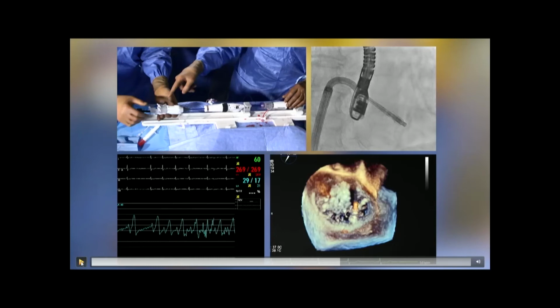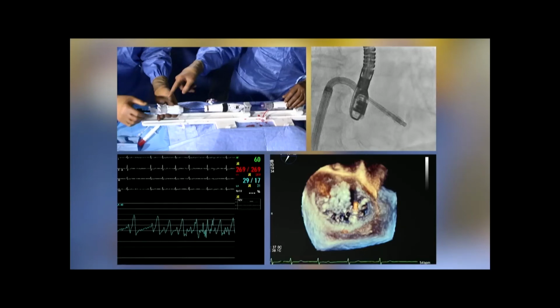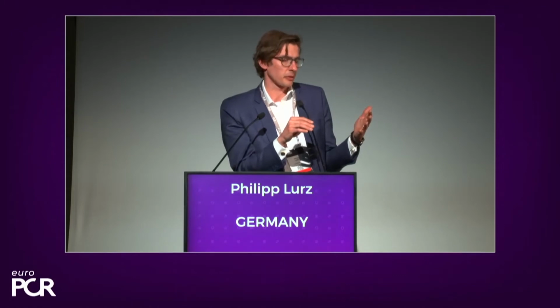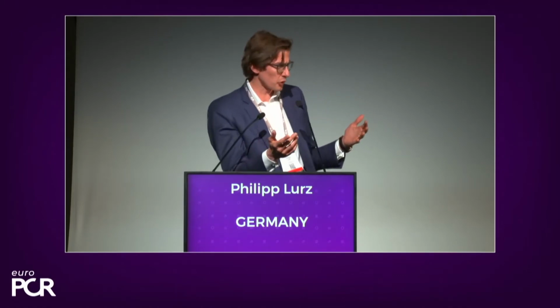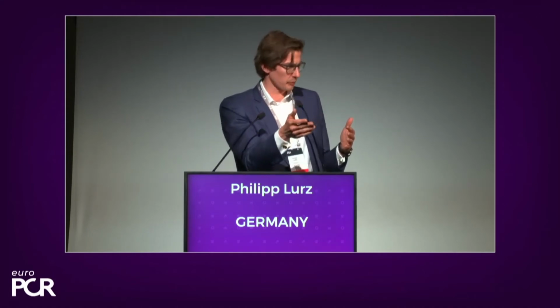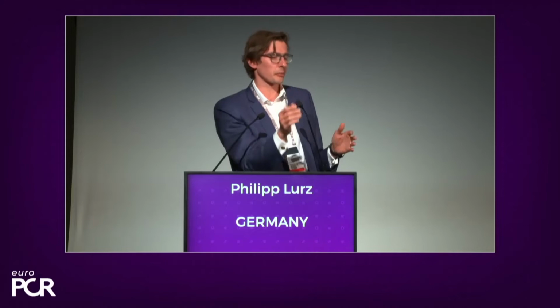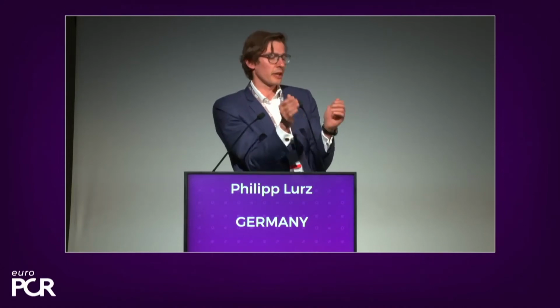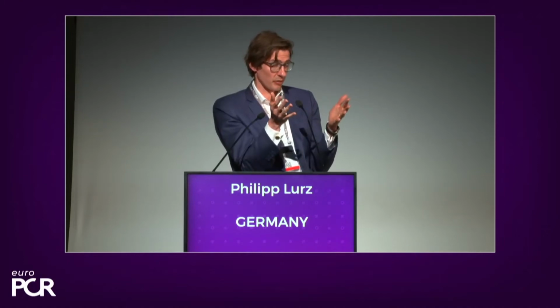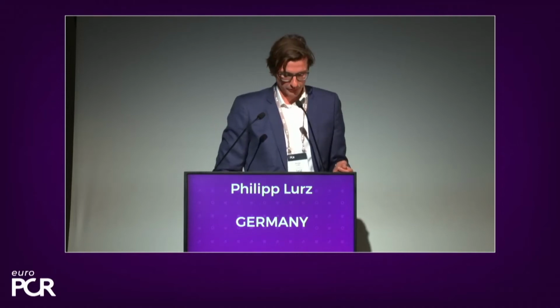Okay, go for it. It's just, at that point, did you think about the clocking of the device? Yeah, that's part of the opening of the device, right? Because once it's closed, sometimes it's more difficult to appreciate whether the clocking is perfect or whether the clocking stayed exactly the same. That's why the idea was to open it up, maybe correct the clocking, but also move in a little bit more medially. Because although we did not have a lot of residual MR, we could see that there is still prolapsing or flail tissue. And that was the rationale behind it.